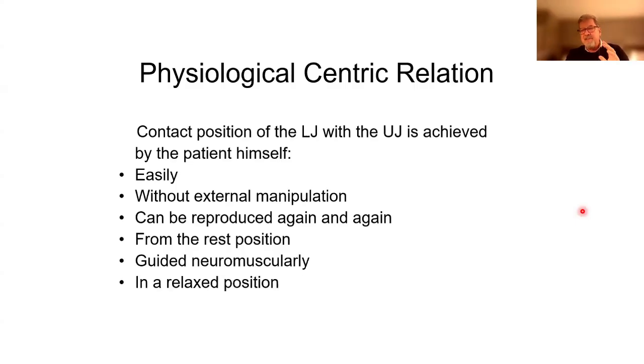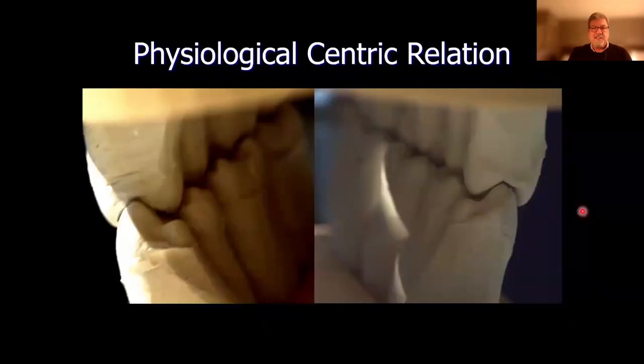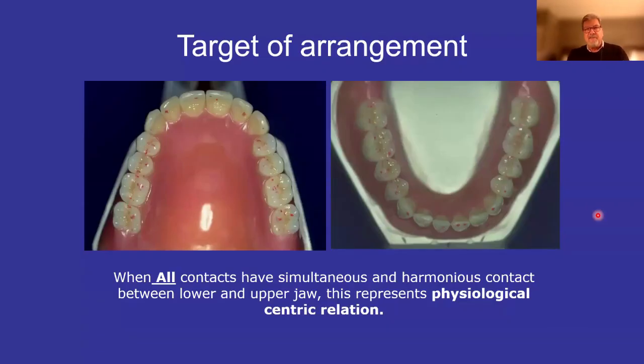And we want that patient in a relaxed position, and in an upright posture also. So look at this physiological centric relation on these models here. It's really a tight relationship here, so there's a lot of contact points. And I'm going to explain that just a little bit in a few minutes here. But look at the target of arrangement here.